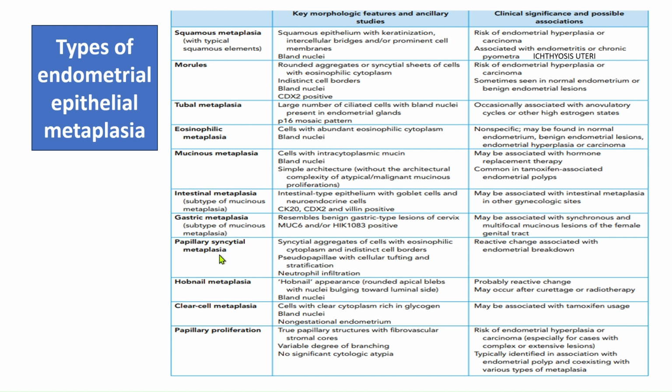Now, papillary syncytial metaplasia. So, here there are syncytial aggregates of cells with eosinophilic cytoplasm and a syncytial look, so indistinct cell borders. Here pseudopapillae with cellular tufting and stratification are there, and neutrophilic infiltration is generally present. This is a reactive change associated with endometrial breakdown.